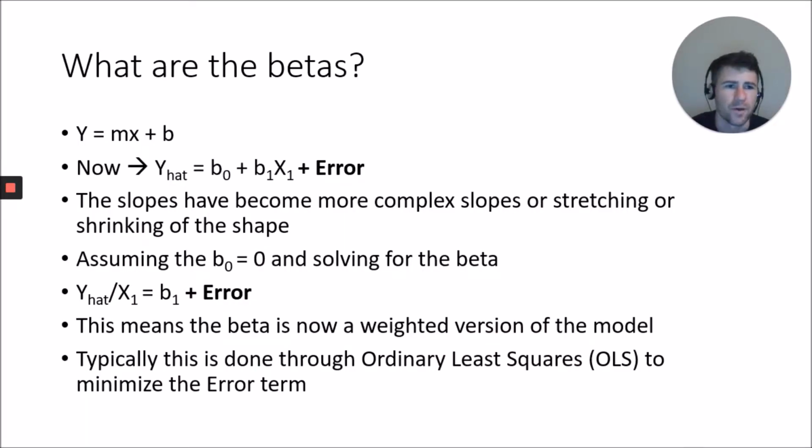So once we have the model, once we've created the design matrix, eventually we're doing statistics on these beta values, and a lot of people don't know or understand what these beta values are. And I think they're needlessly complicated. So going back to basic algebra, you have the line formula. If y equals mx plus b, well, just as I mentioned, a line is a model. You can actually model data using a line. So we have a very basic model, y being the output, m being the slope, x being the input, and b being the y-intercept.